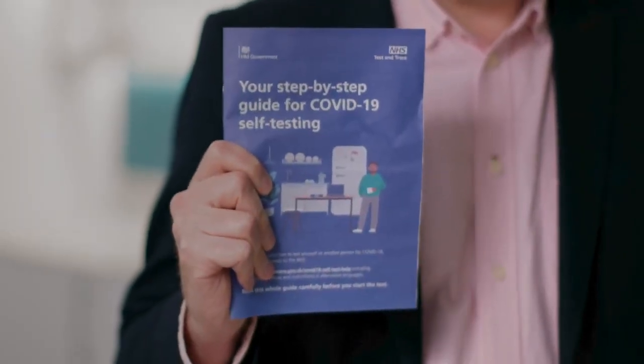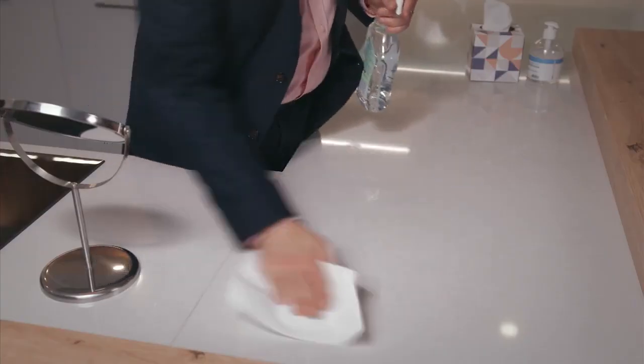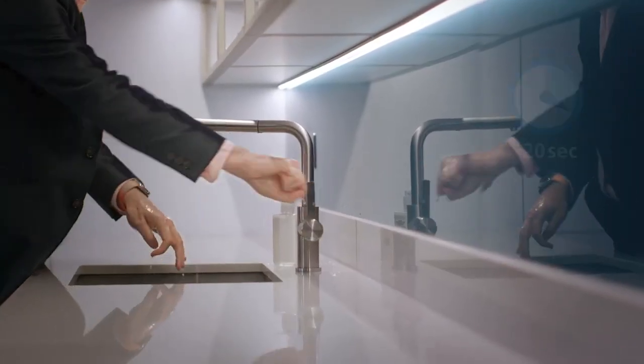Read the instructions for use that come with your kit before you start, as they may vary slightly to what we're showing you here. Remember, don't eat or drink 30 minutes before taking the test. You need to swab both your throat and your nose. If you've had a nose bleed in the last 24 hours, swab the other nostril or wait 24 hours. If you have a nose piercing, swab the other nostril. If you have a piercing on both sides, remove the piercing on the side you are going to swab.